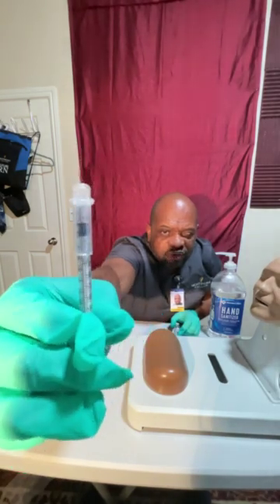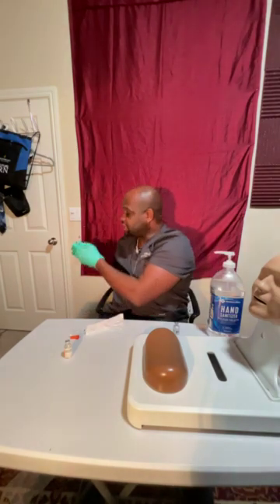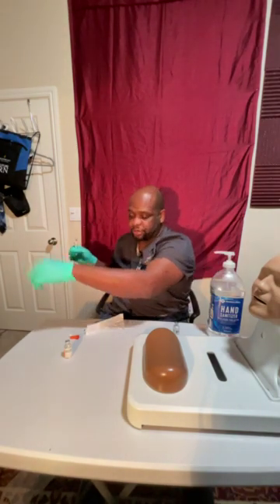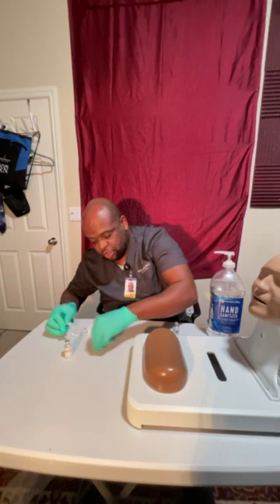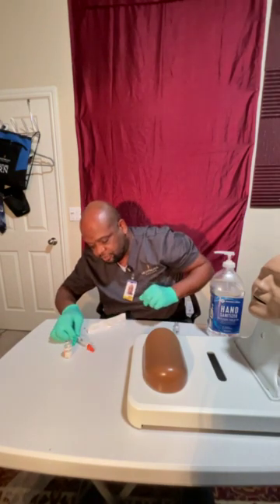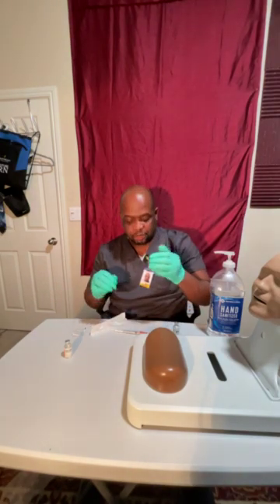Now I'm going to show you guys that one. There's 12 units, right? Now I'm going to have Nurse Agnes confirm. When I say confirm, she's looking at the amount of medication there, and she's checking the MAR. And because I got to prep the patient to receive this injection, I'm going to do a 1-hand scoop for safety reasons, right? And because I'm at the patient's bedside, I don't have to label this because I'm preparing everything right in front of the patient. But if I was away from the patient, I would label it first with what's in the syringe. Then I'll take it to the patient's room. But I don't have to do that. Thank you very much.